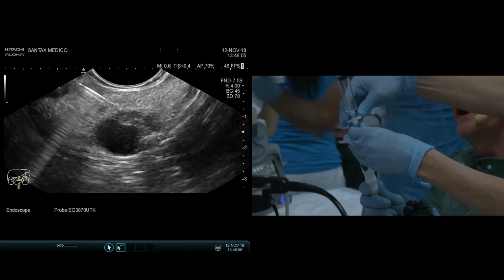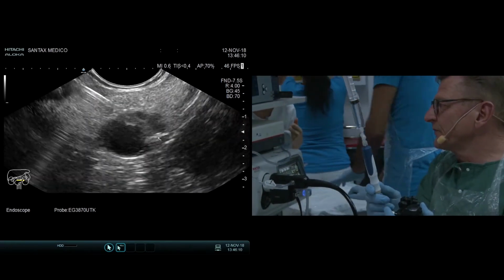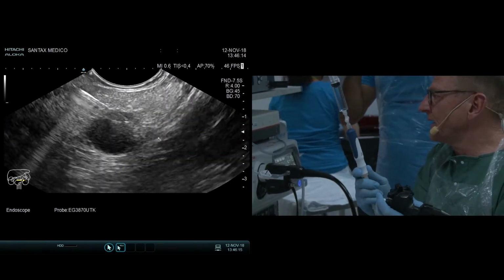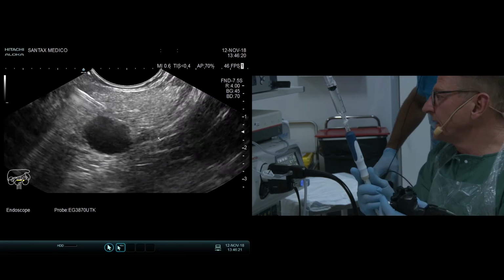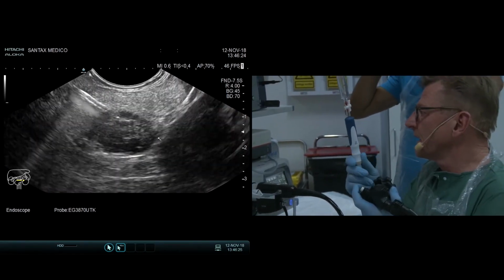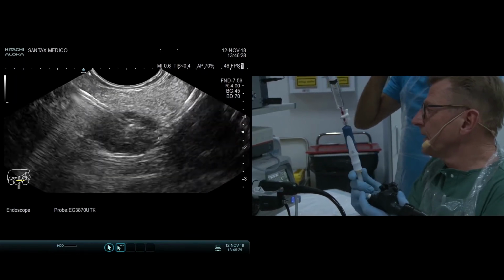You know, it was interesting for me also to notice, did you see how it emptied? Yeah, that it actually emptied the cyst. And let's see here.